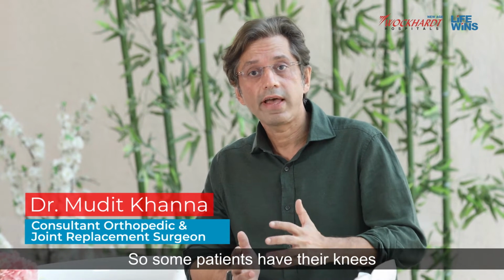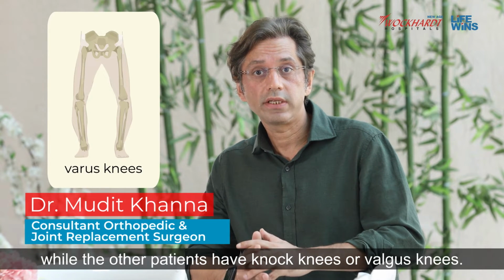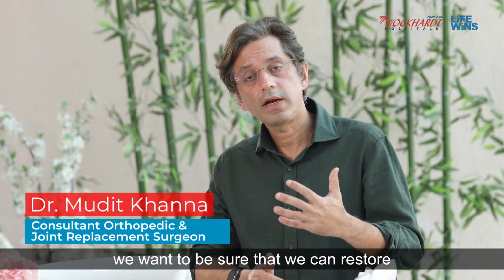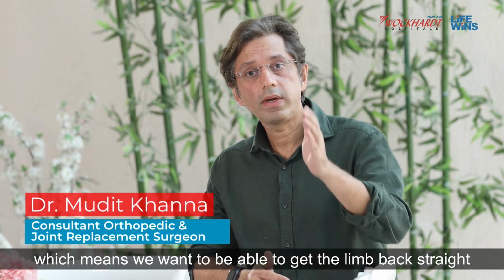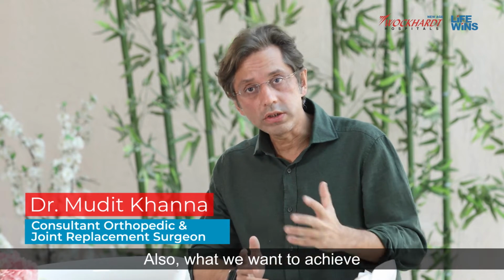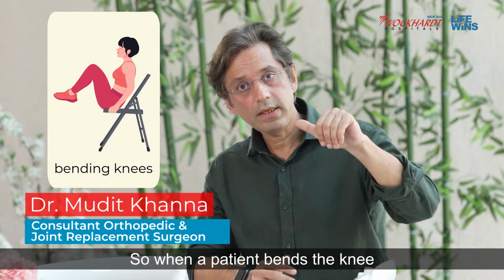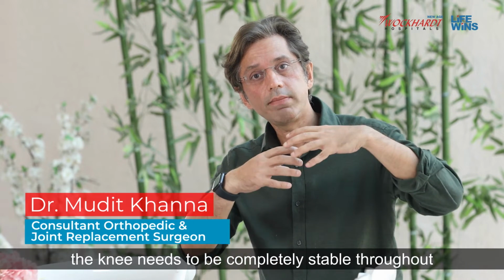Some patients have their knees more as bow legs or varus knees, while other patients have knock knees or valgus knees. When we perform this surgery, we want to be sure that we can restore the normal alignment of the limb, which means we want to get the limb back straight to neutral. Also, we want the knee to be stable through its entire range of motion. When a patient bends the knee and straightens the knee, it needs to be completely stable throughout.